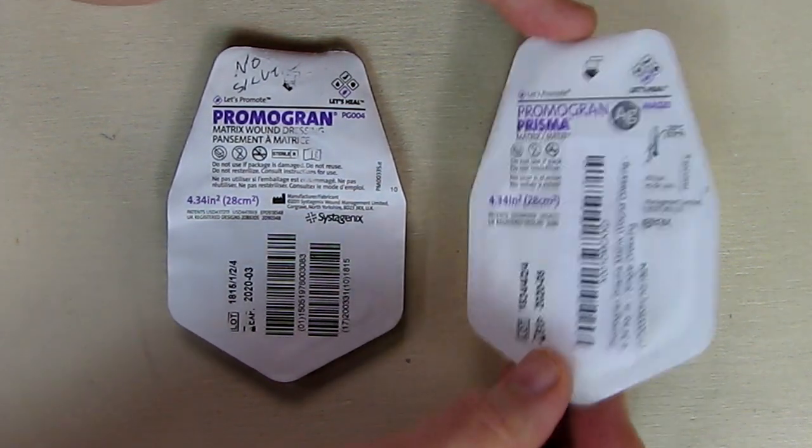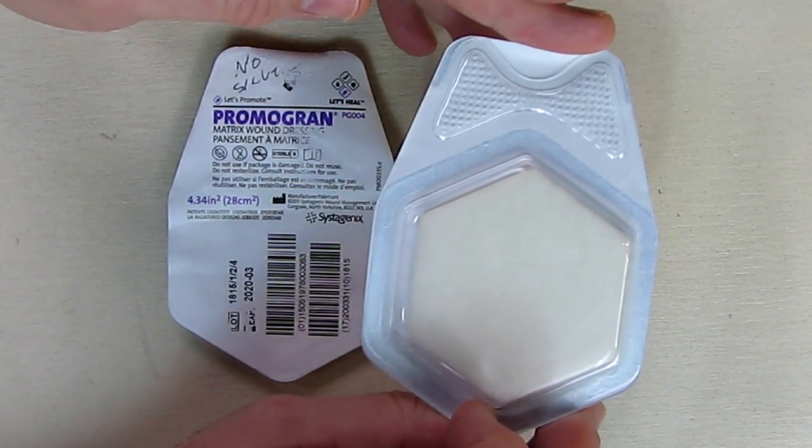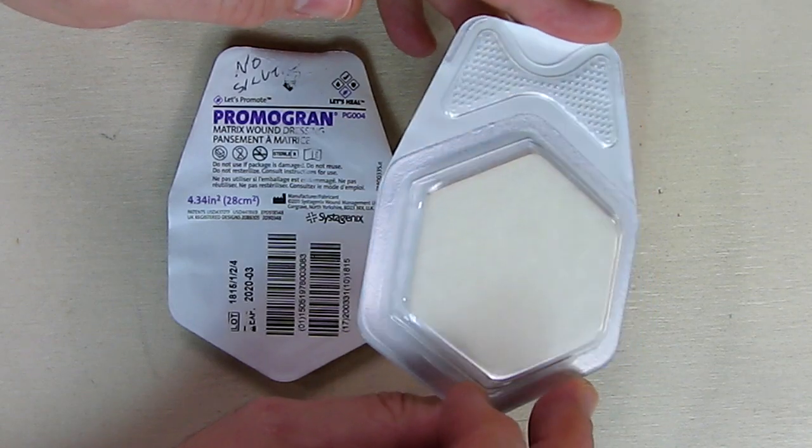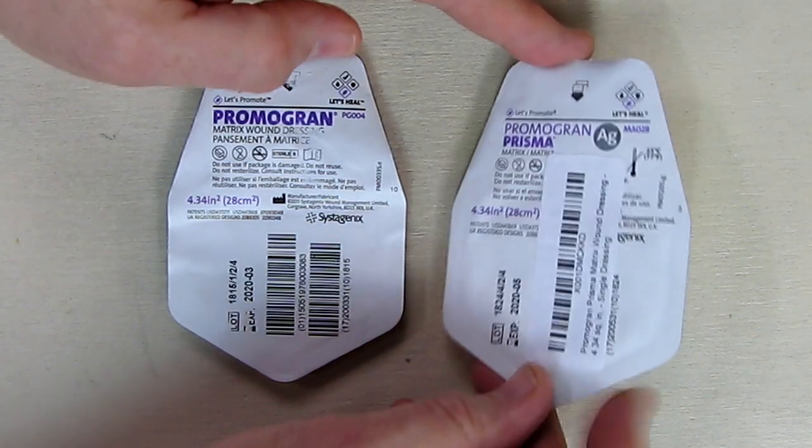This product — the one with the silver — is the same packaging. You can see it's the same size; it even looks the same, but it has that silver added into it.